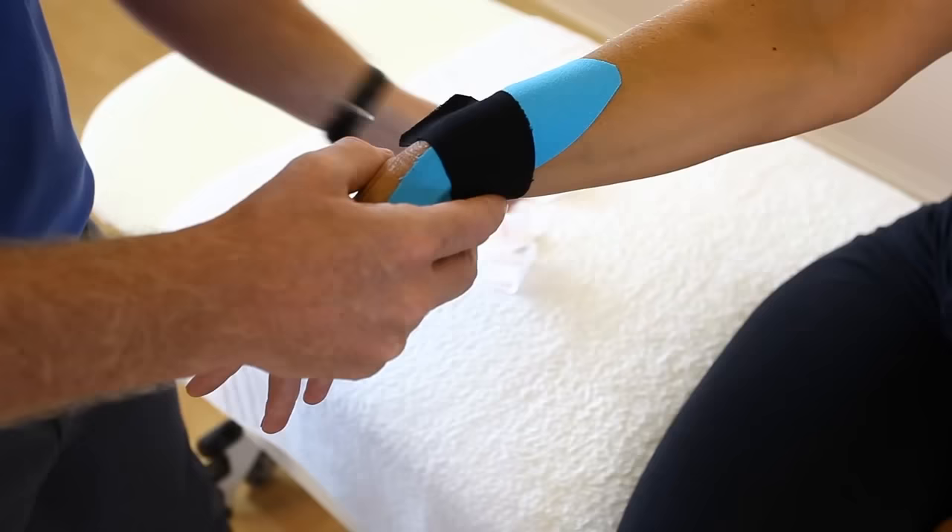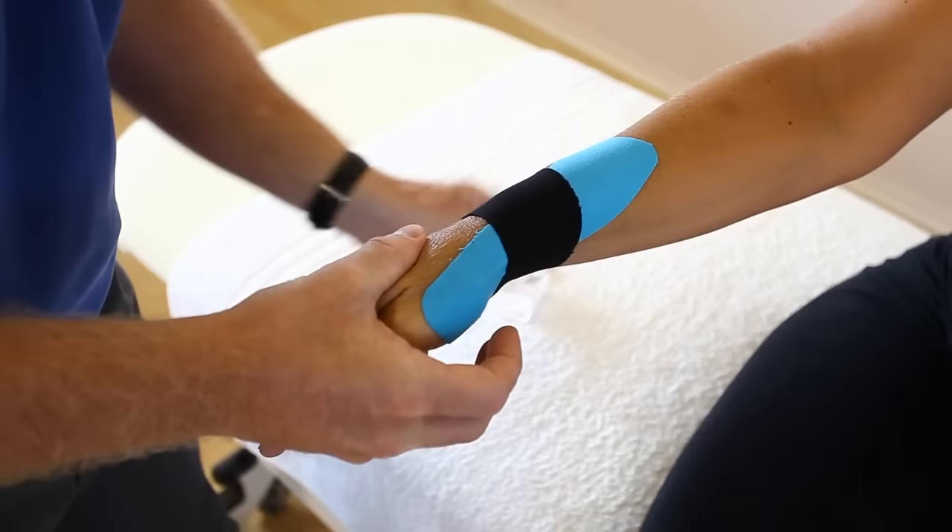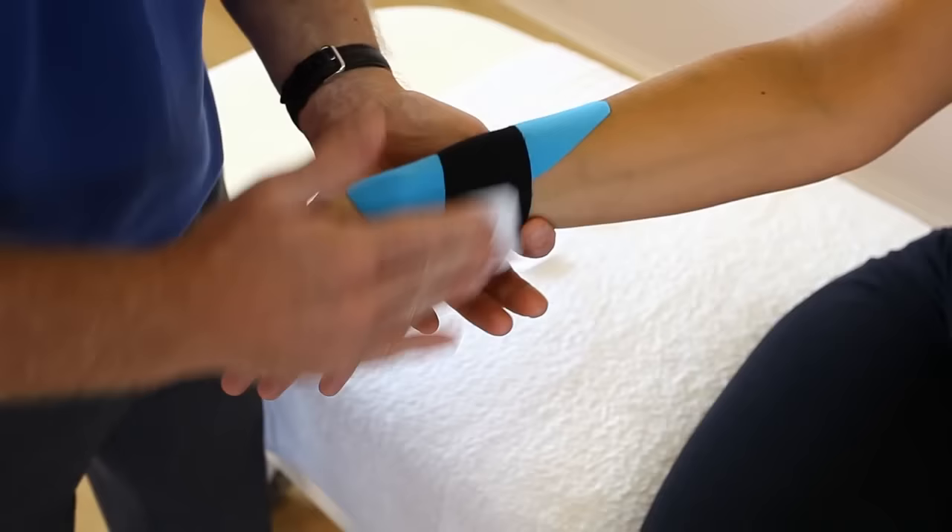Once we've applied those two bits of tape, we can use the back of the tape to just warm up the adhesion — it will make it stick a bit better. And there you have kinesiology tape applied for the thumb and forearm.